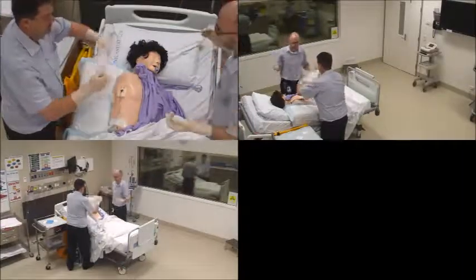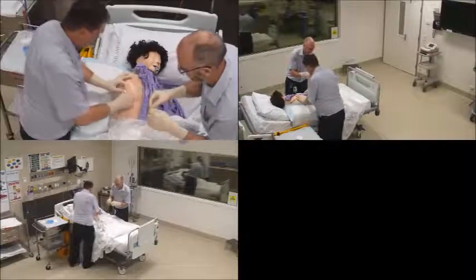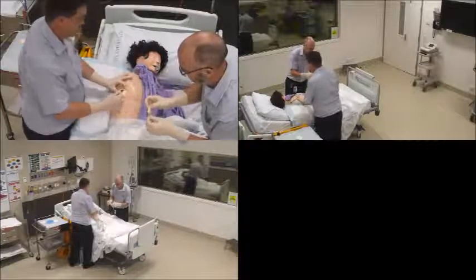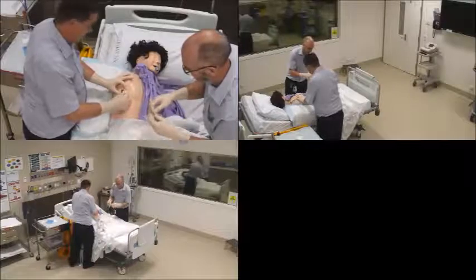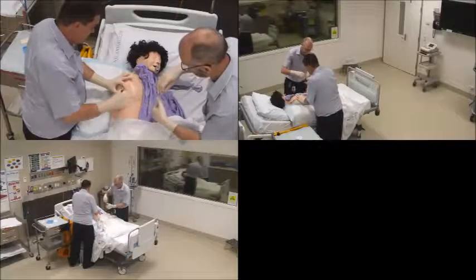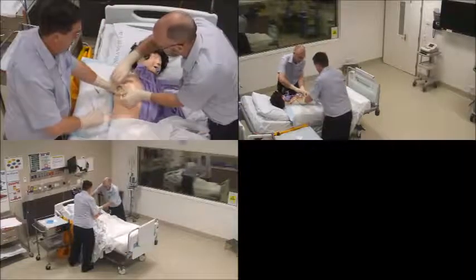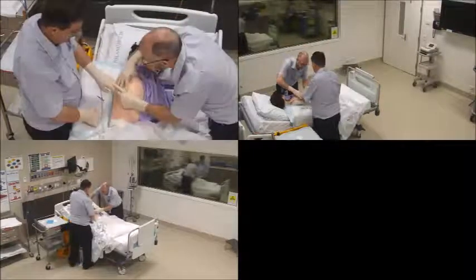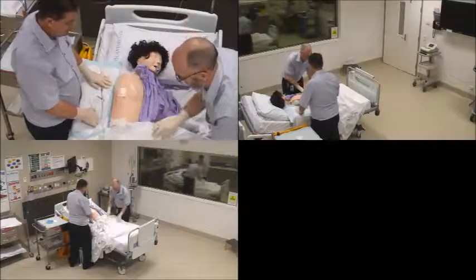Then, position the fingers of your non-dominant hand as wide as you can near the drain insertion site and ask the patient to perform the breathing technique, holding their breath. Once they reach peak inspiration and are holding their breath, cut the suture and remove the chest drain using a brisk but firm technique. The drain should be removed in one smooth motion, pinching the patient's skin. The assistant nurse then applies the Steri-Strips and dressing. Don't be concerned if your fingers are caught up in the Steri-Strips, they will release when the dressing's applied.